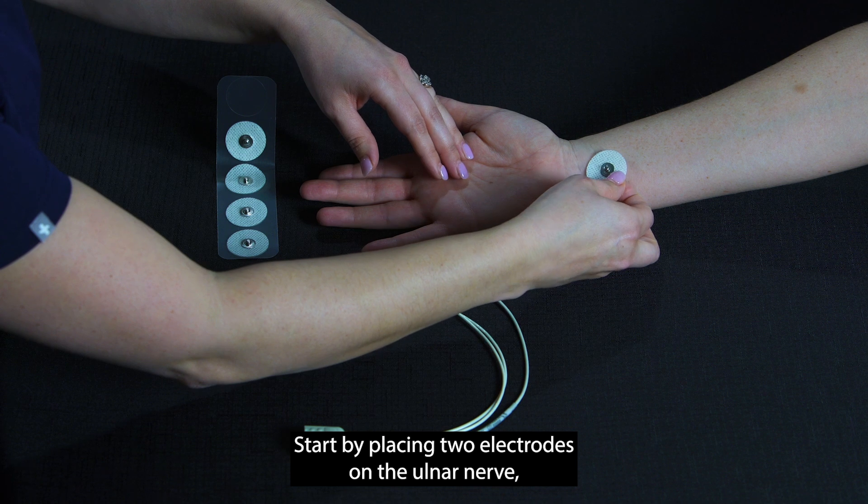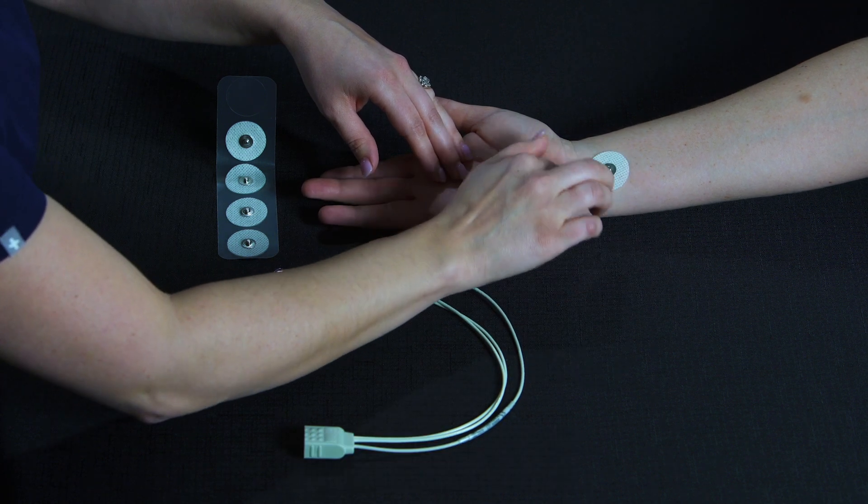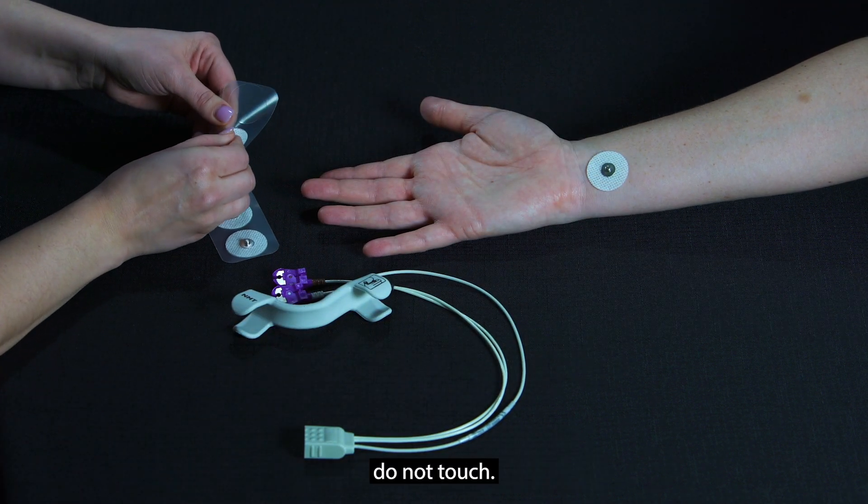Start by placing two electrodes on the ulnar nerve, ensuring the edges of the electrodes do not touch.